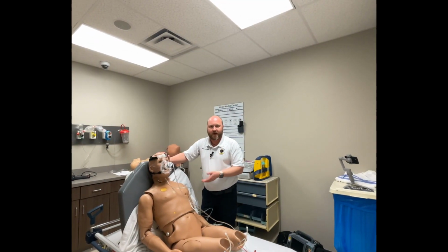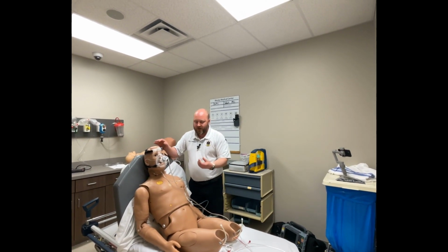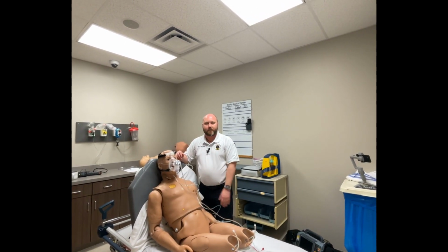Reevaluate your patient, check for breath sounds, recheck your capnography, and if you need to give a breathing treatment, this just plugs straight into the bottom at your normal 6 to 8 liters per minute, and that will give the breathing treatment through the CPAP device.